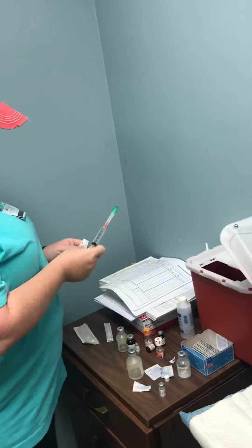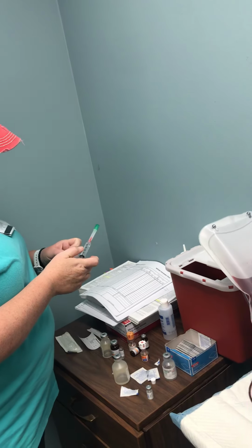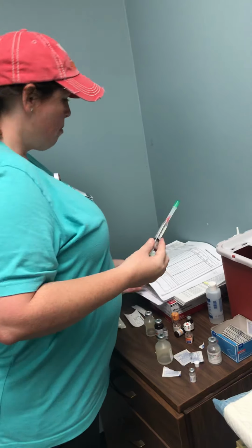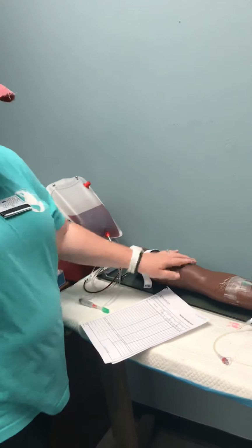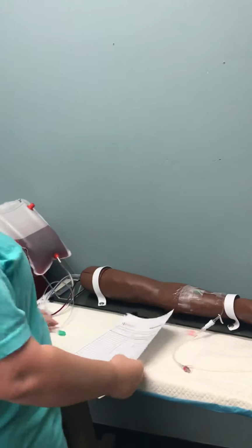Before I leave the med room, I'm going to label my syringe with my patient's name, the drug, the amount, and the expiration. So now I'm going to go to my patient's room, and I'm going to check my patient by 2 identifiers. His patient name and date of birth against his armband and against my MAR and against my medicine.